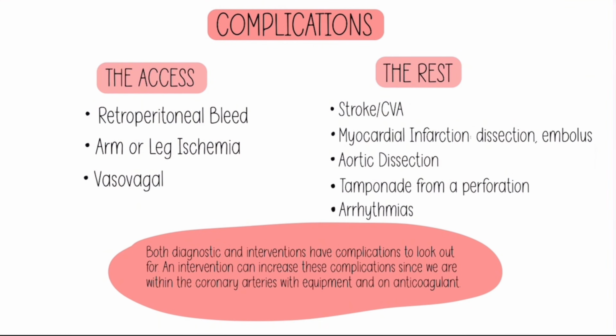Because if you do it with the thrombus in there, then when you inject the sheath, that thrombus comes out and can get stuck in that artery and close off blood flow to the hand or leg, which we don't want. So there are, again, preventative and proper ways of doing that, but make sure you learn sheath management really well if you are scrubbed in.